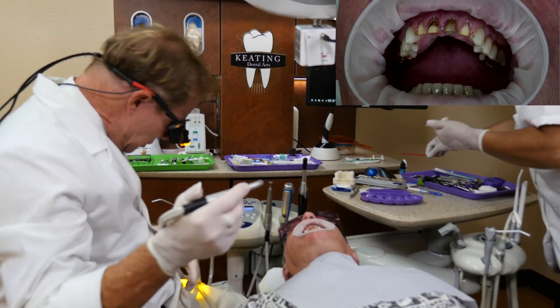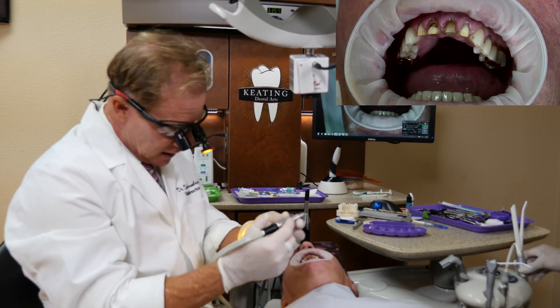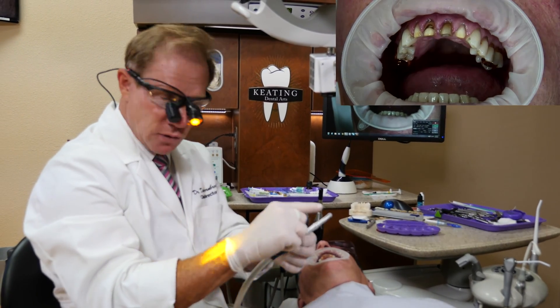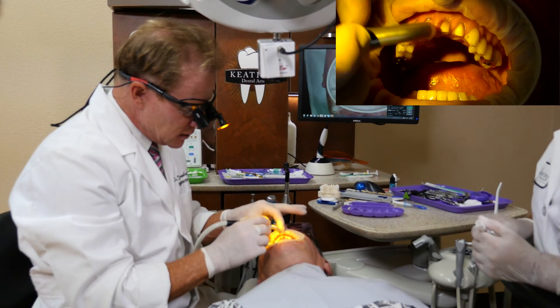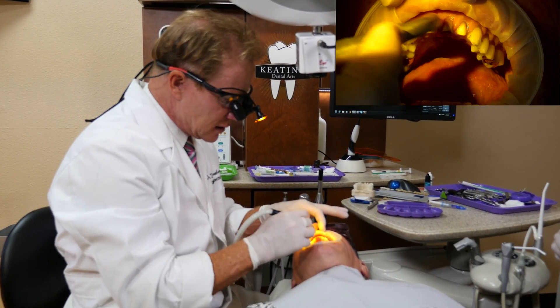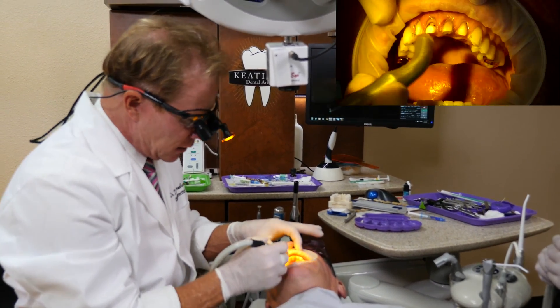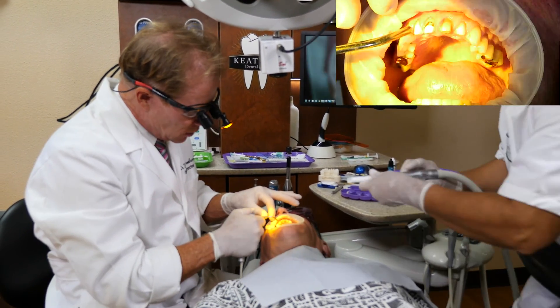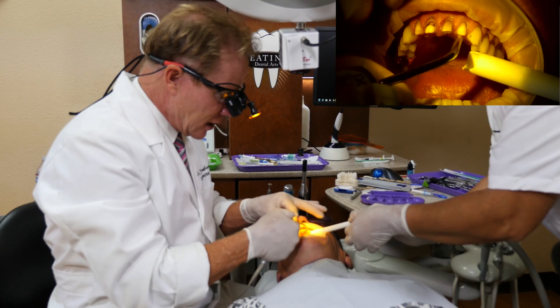Now we're going to dry thoroughly with moisture-free air. This is an ADEC — A-D-E-C — warm air tooth dryer. It's a Venturi system: when I put my foot on the rheostat, air runs through the Venturi system and eliminates any moisture, creating warm air. We need to completely evaporate the alcohol because this is an alcohol system. We apply this first, and we shouldn't see the resin move around at all anymore. Then we can take our regular air water syringe and aggressively evaporate off that volatile carrier — that alcohol.